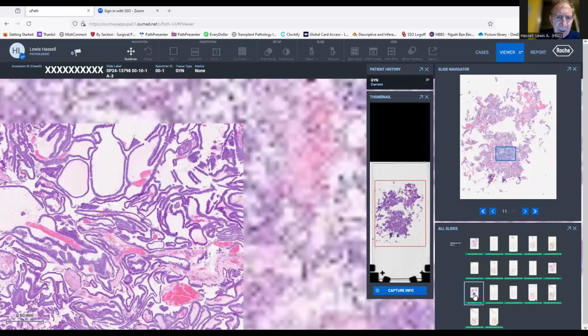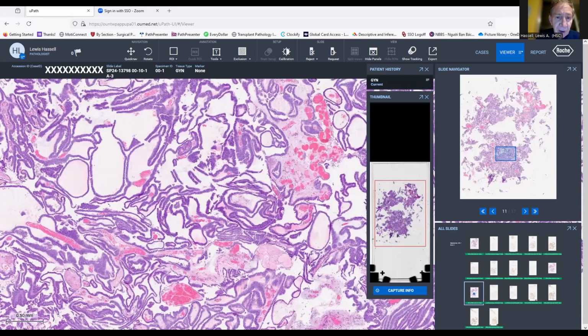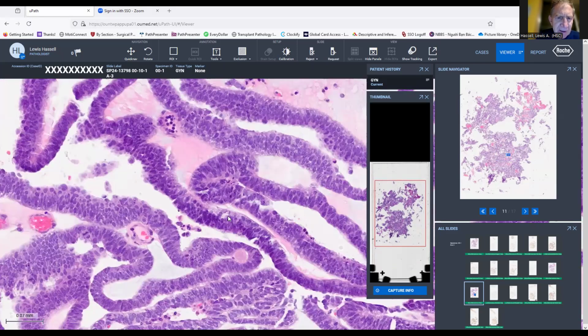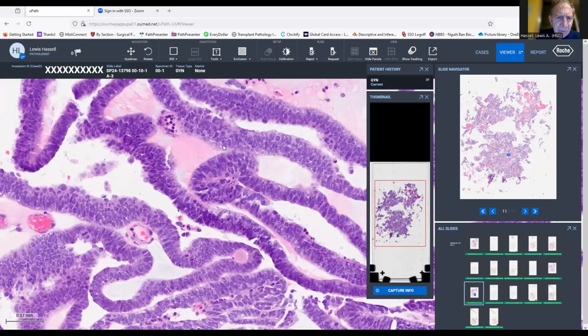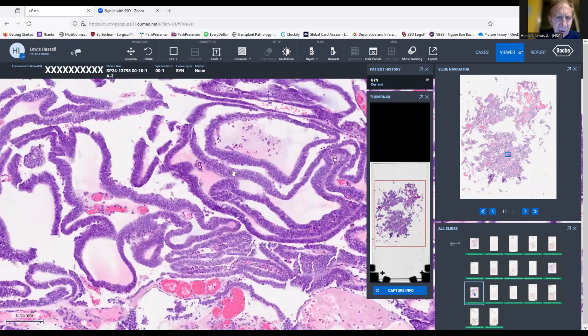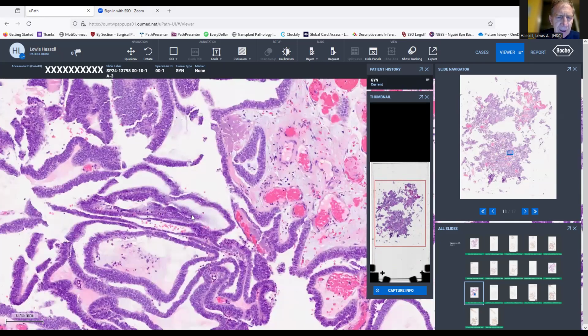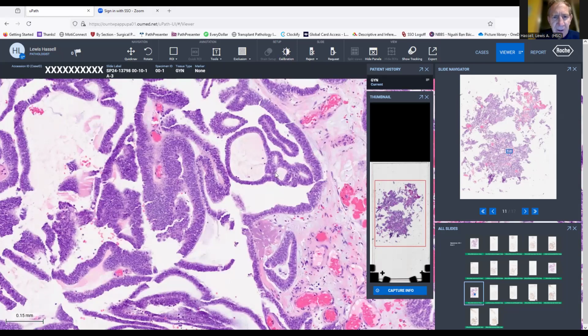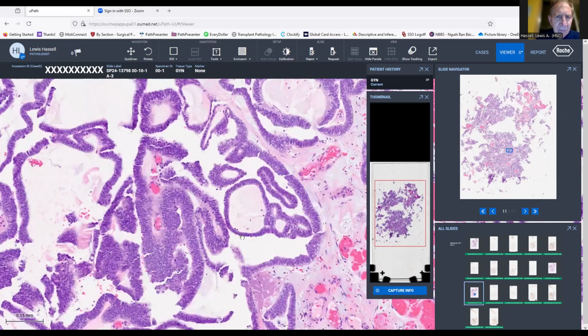Since this is not an endocervical tumor, it's not staining with the markers that we would expect with endocervix, but while it does have PAX8 positivity, it's hormone marker negative. So that made me a little suspect. If it were an endometrial tumor, it should be a low-grade, well-differentiated tumor because it's all glandular, no solid growth, and that's not what we're seeing here. So I wondered, could this be an atypical or an unusual variant of endometrial adenocarcinoma?